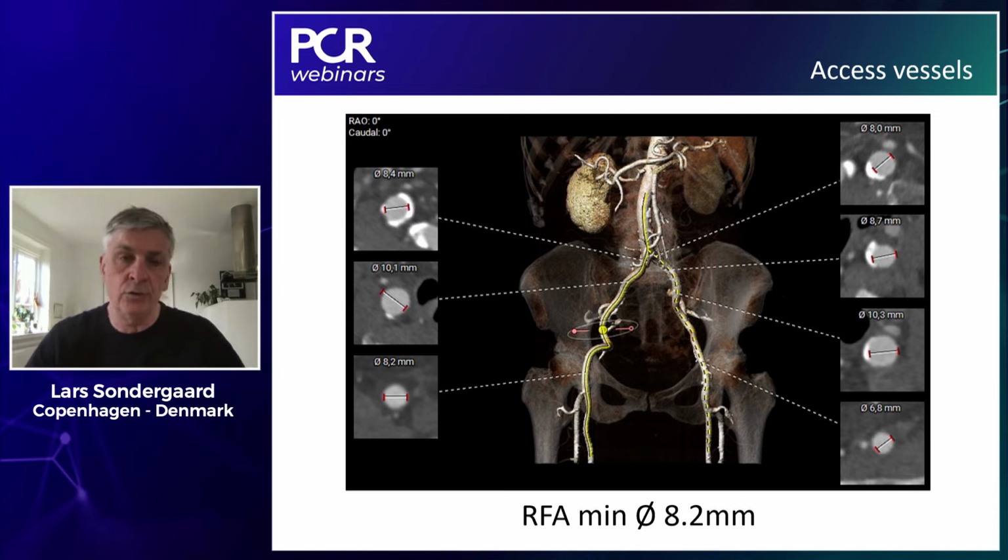Francesco, you as a surgeon know that some of these patients are prone to have early valve failure. And of course, that's particularly important if you treat patients with longer life expectancy, to ensure that the patient will have a bioprosthetic valve which is going to last long. So what patient characteristics, and also particularly for the aortic valve, are going to determine the durability of these valves, or are going to put the patient at risk for early valve failure?